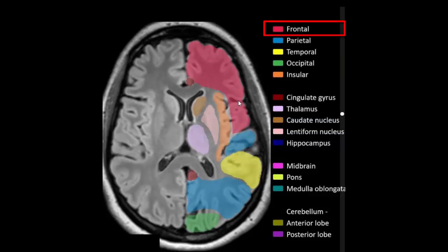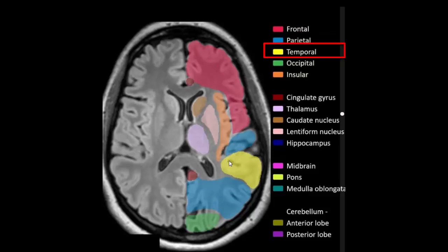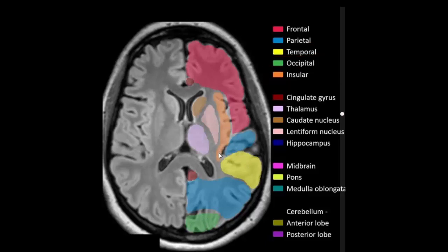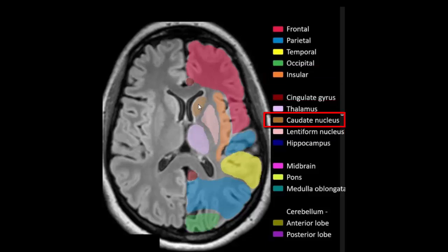Frontal lobe, parietal lobe, temporal lobe, occipital lobe, insular cortex, lentiform nucleus, thalamus, head of caudate nucleus. Right and left anterior horn of lateral ventricle.